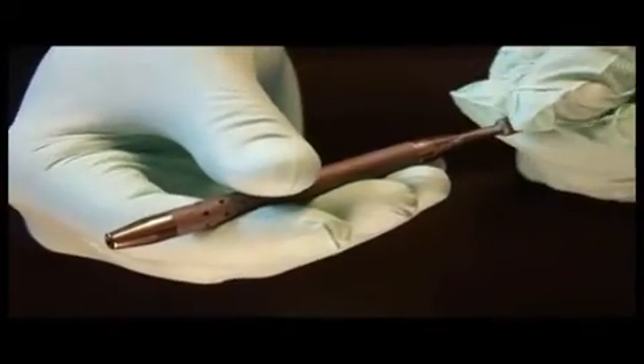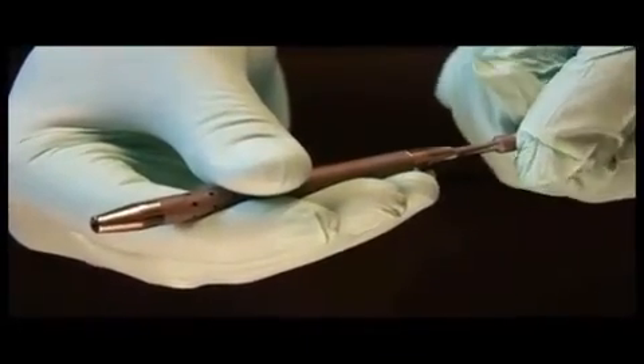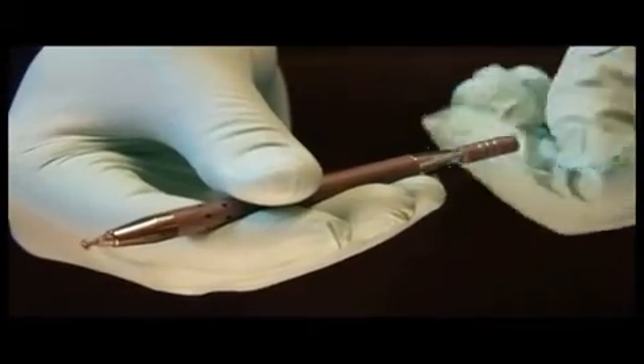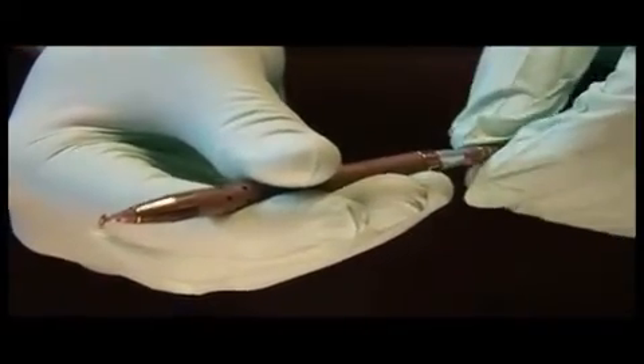The Mastel President features a free-floating design. Initially, the retracted blade is locked in position. To release, hold the body firmly and twist the thimble clockwise until free. Advance to the fully extended position. Continue clockwise until the mechanism is locked. This is the in-use position.